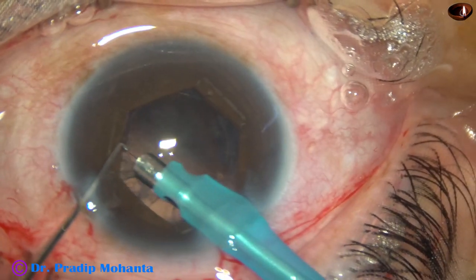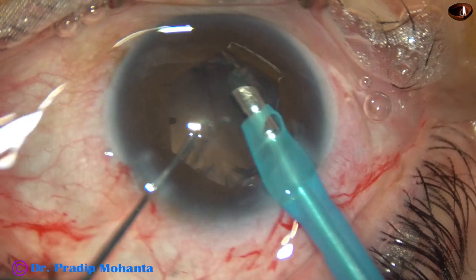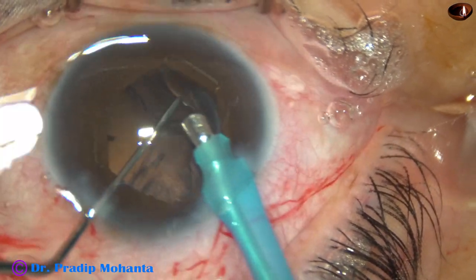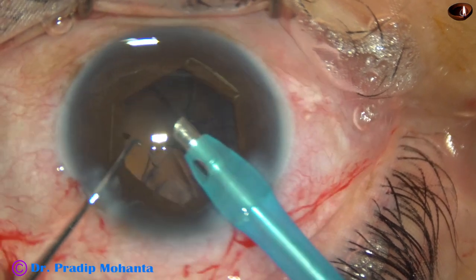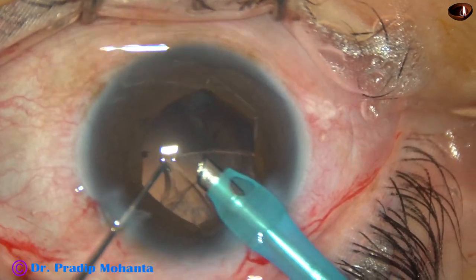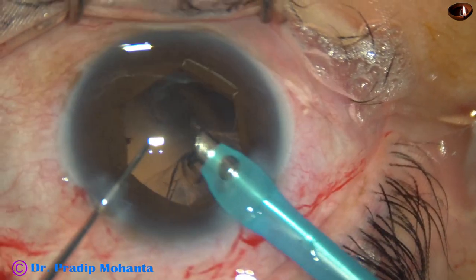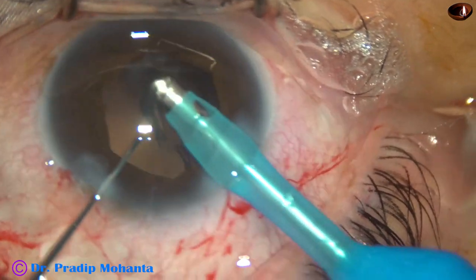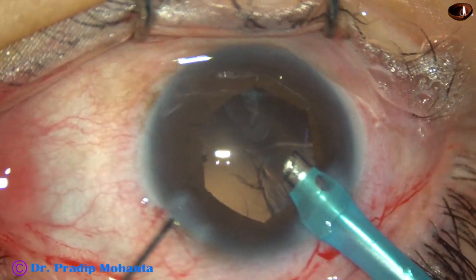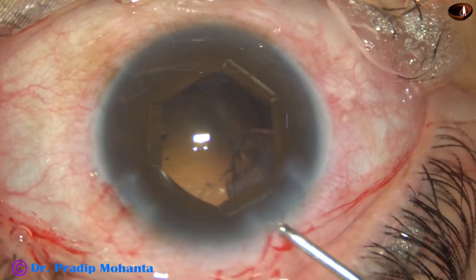Now I am trying to remove some cortex by the phaco needle itself. For this, the anterior chamber stability should be very good, the posterior capsule should be far behind, and the control over the machine should be excellent. A lot of cortex has come out; the rest of the cortex we can manage by a Simcoe cannula.